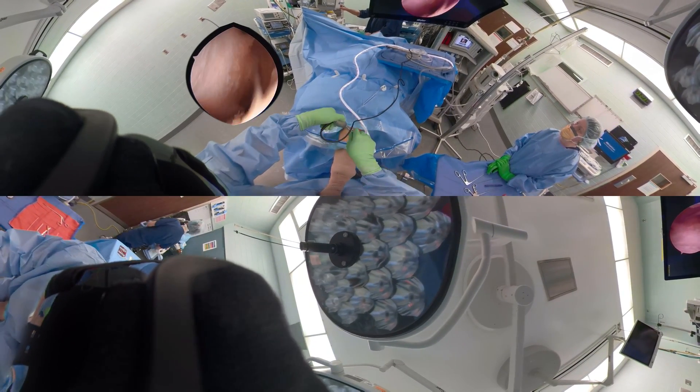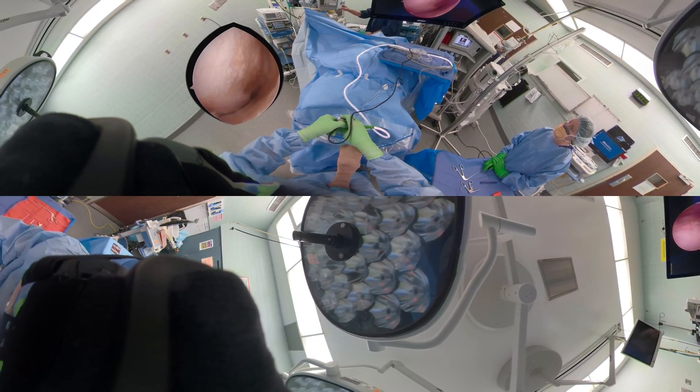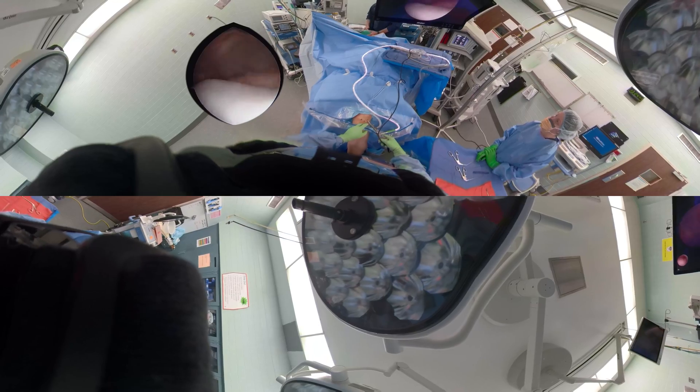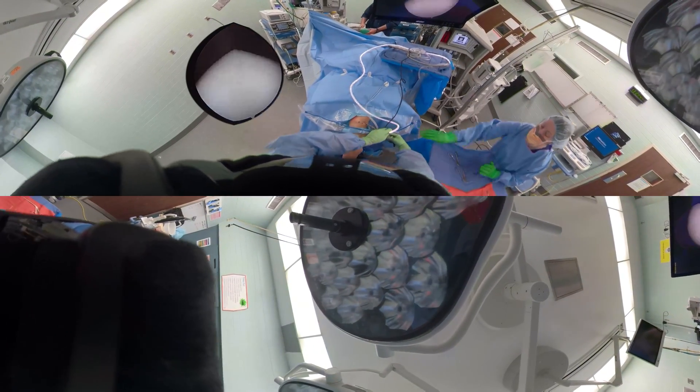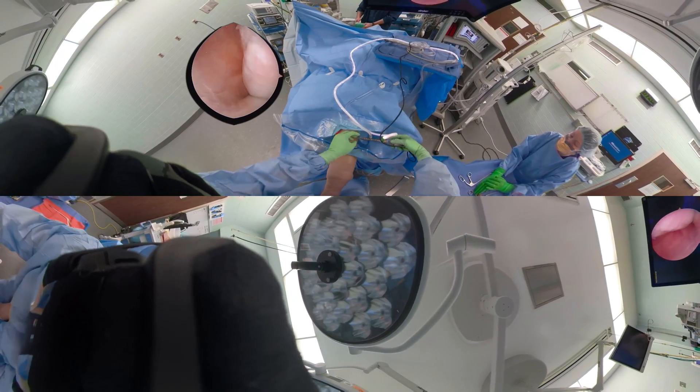This is going down into where the popliteus tendon lives in the lateral gutter. For loose bodies, oftentimes they are in the suprapatellar pouch or one of the gutters — either the medial or the lateral gutter. This here is a plica, a plical fold.